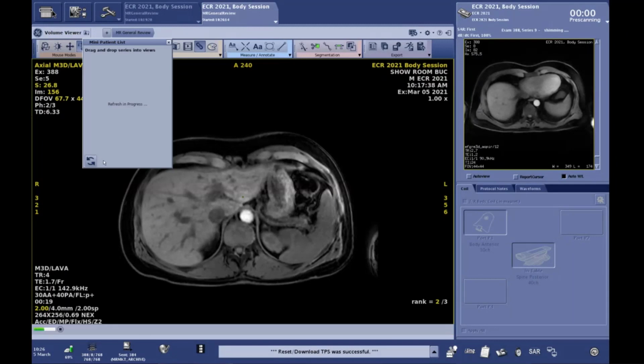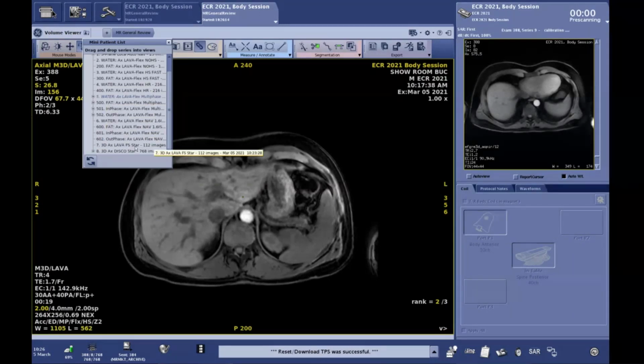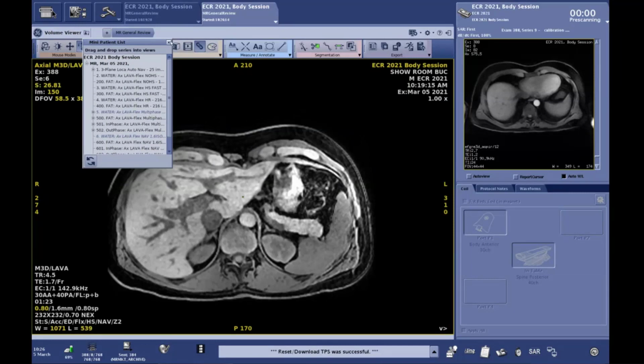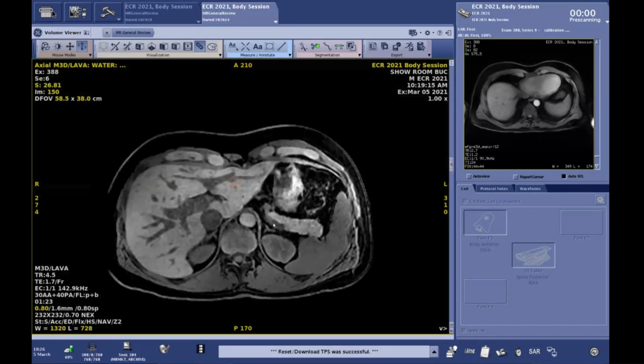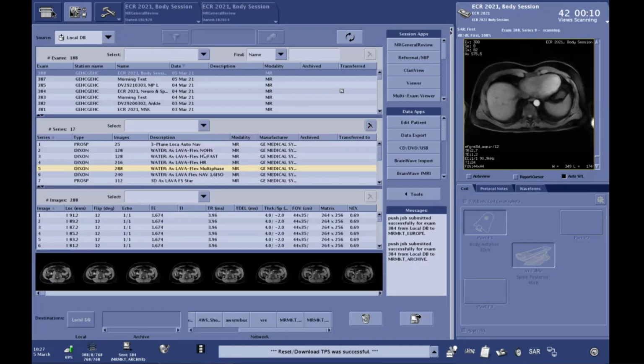And yes, I have a review now of our navigated 1.6 isotropic acquisition. Jeremy, can you hold here for a minute on this patient list? Because I've been explaining in the chat that the Flex is a Dixon-based technique giving multiple contrasts. This is something that the system will automatically generate for you.